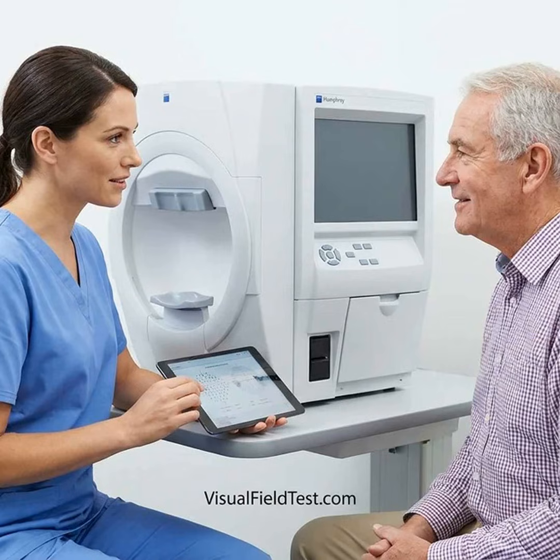During the test, sit with your forehead and chin comfortably supported. Keep looking at the central fixation target. Press the button only when you see a light, following the instrument-specific instructions. Do not move your eyes toward peripheral flashes. Blink normally. Do not worry about missing occasional lights. Ask for a pause if you are tired, uncomfortable, or need to reposition. Take a short break between the two eyes if permitted. Tell the technician if the corrective lens, eyelid, or face position is uncomfortable. Patient-friendly guidance commonly emphasizes normal blinking, steady fixation, and communicating when a pause is needed.